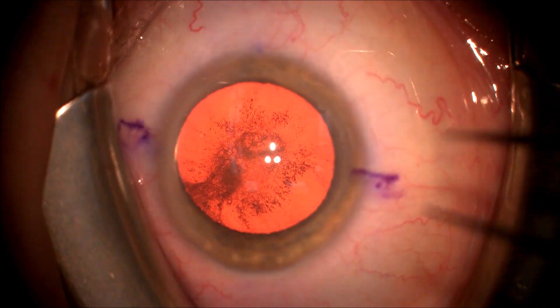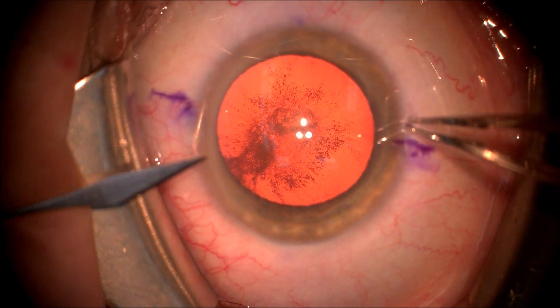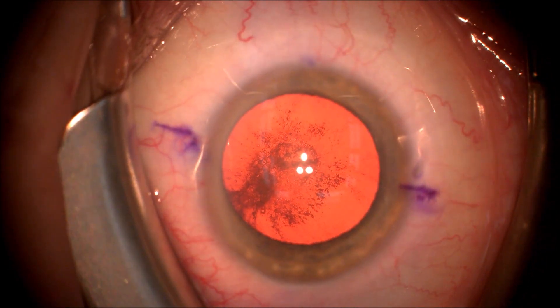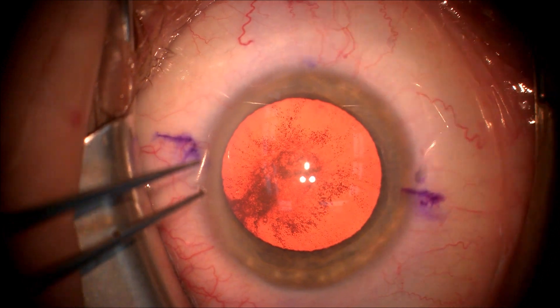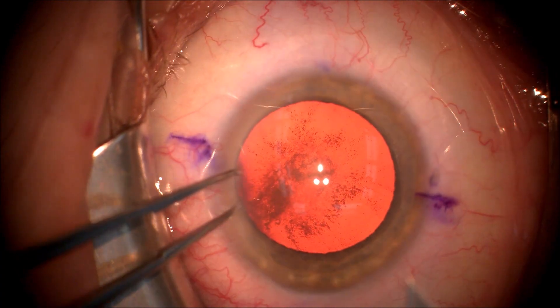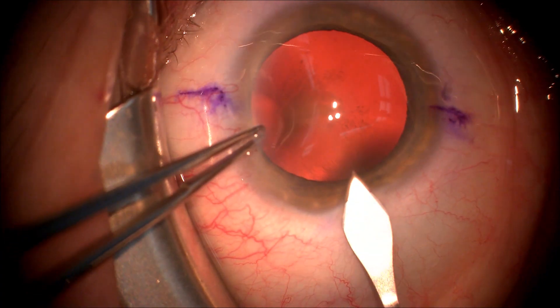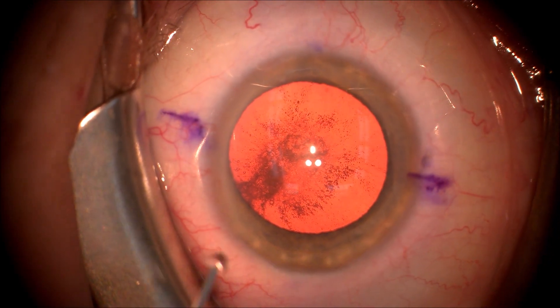This is a patient with a posterior subcapsular cataract who has been marked at its steep meridian. We're going to make a side port incision with a 15-degree blade and 0.12 forceps, then make the main incision with a 2.4 millimeter double-sided clear cornea blade, keeping this as a paracentesis incision as well.